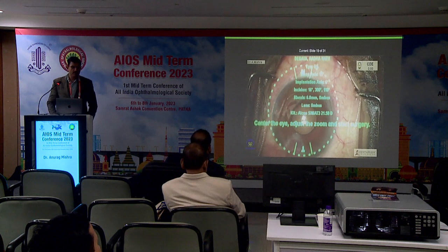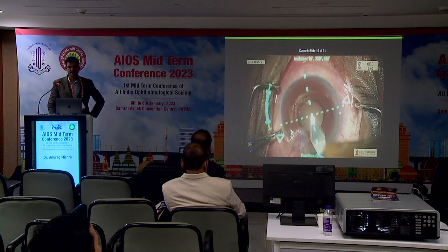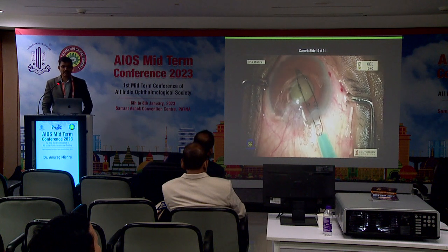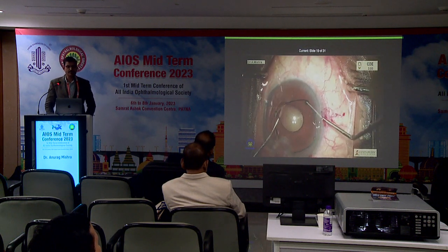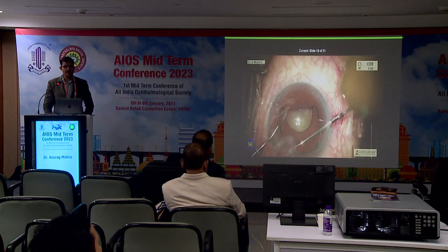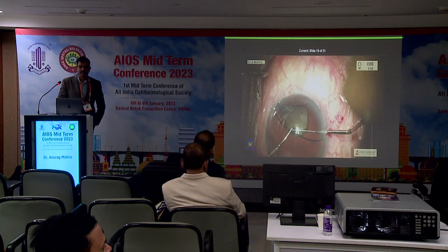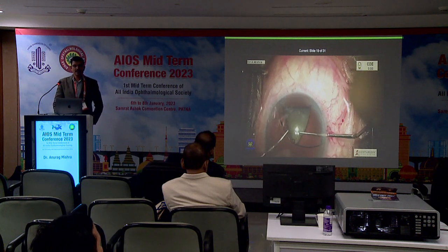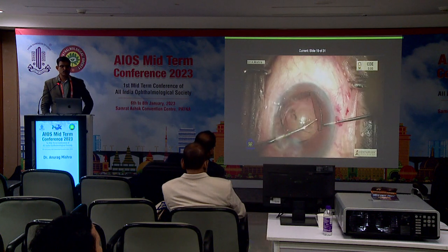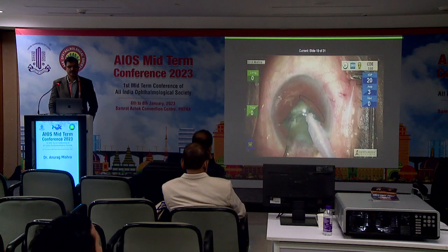This was again a one-eyed patient wherein there was a long-standing corneal scar due to a pseudopterygium. I didn't find any point in removing it. This is a Gupta's ring, an Indian counterpart. It looks similar to a Malyugin ring, but doesn't exactly function like a Malyugin. The behavior of the pupil is also a little different from what you have in a Malyugin placement. That essentially renders the pupil round, whereas this converts it to a little squarish shape. But post-operatively, it behaves quite well. It actually preserves its light reaction quite well.